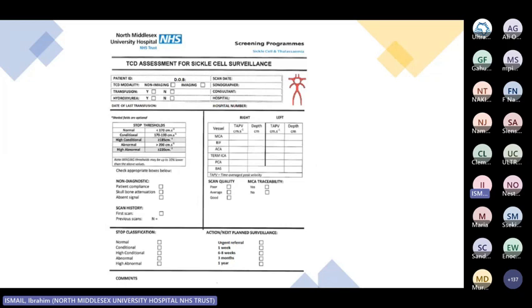It's no longer diagnostic. It's no longer beneficial to continue the diagnostic process. There could be an imminent risk of stroke at that point. So at this point, we would tailor it to the patient itself.